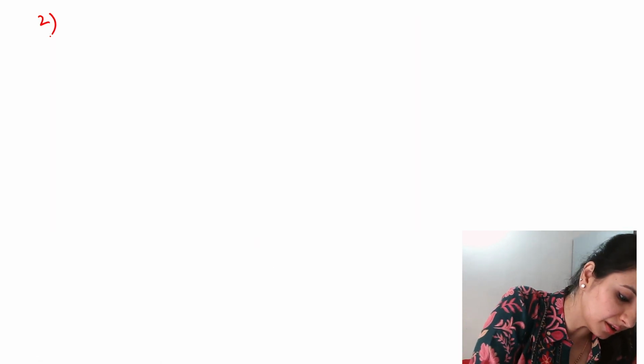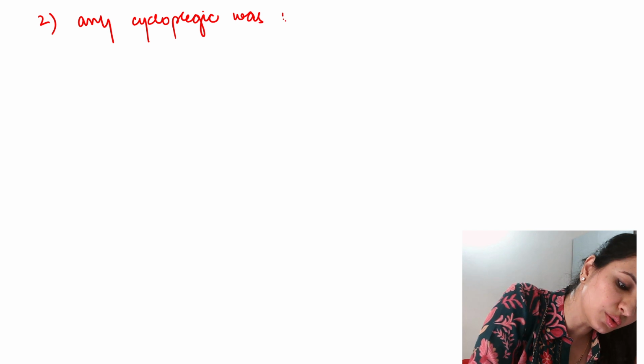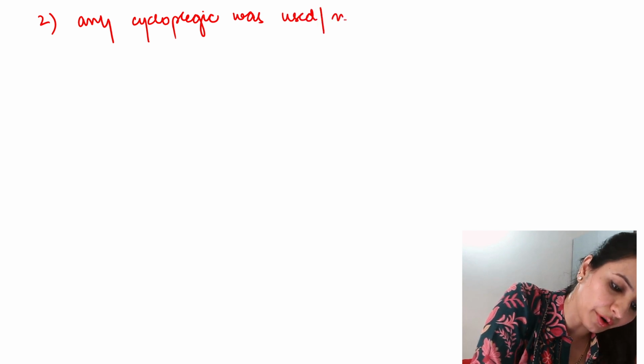Another thing which you need to know is whether any cycloplegic was used or not.